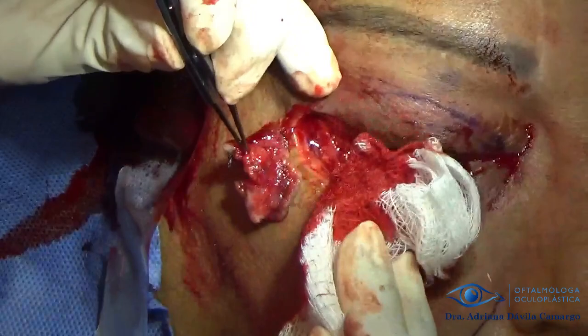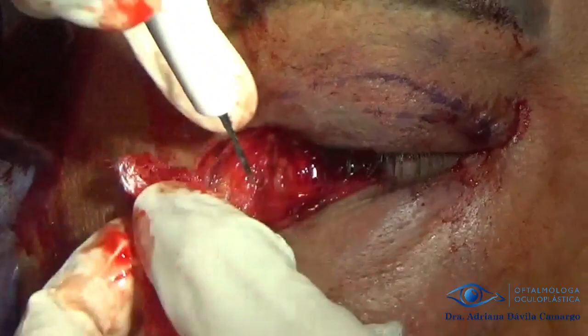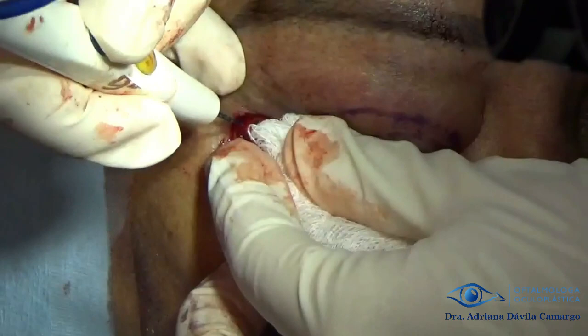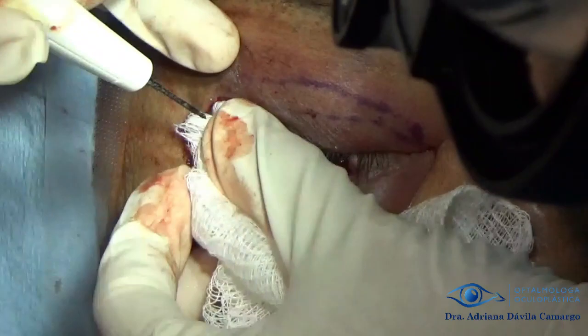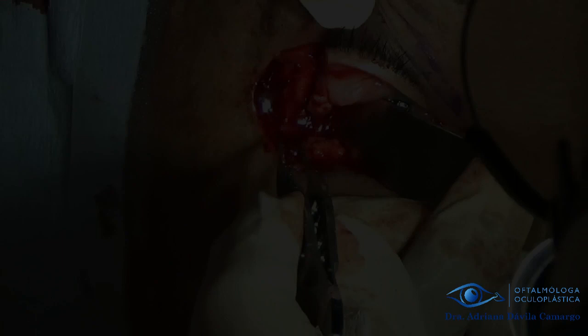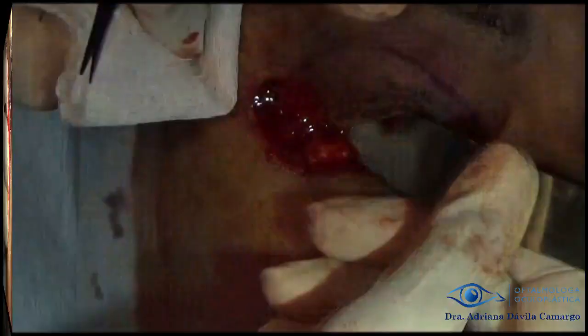Here we remove it and see the defect, and do a little hemostasis with cautery, but not much since what we are looking for is good vascularization of the area. Once we see our defect, we proceed to further clean the area where there is cancer and confirm the clean bed.